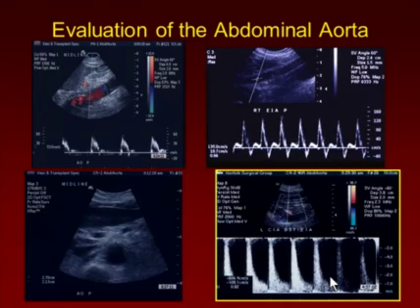When we evaluate the abdominal aorta here, you can see this is the proximal aorta sample being taken parallel to the wall, and you would do proximal, mid, and distal. If there are any increases in size in the aorta as you go down, obviously we're going to measure those. We want to be, as in this example of the external iliac artery, parallel to flow at an opportune Doppler angle to get the optimum waveform.